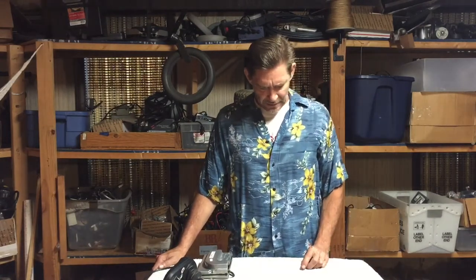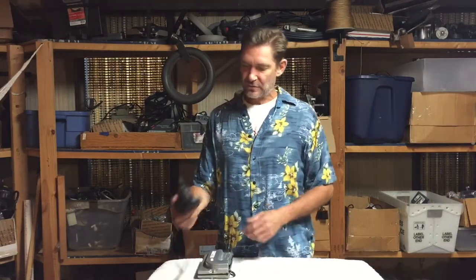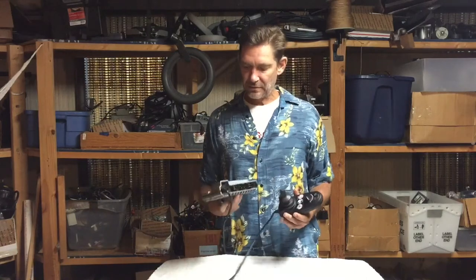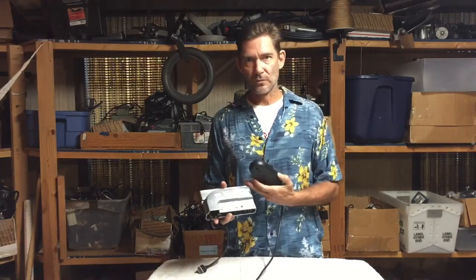Everything else pretty much is going to be a fault code of the control module or the joystick — that's going to be either a seven, eight, nine, or ten flash. When you get into a lot of flashes and you've really exhausted all your options trying to figure it out, you're down to the joystick and the control module. In my experience, it's 50/50 — it's going to be either the joystick or the control module.